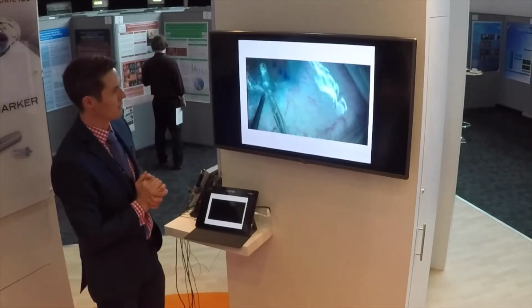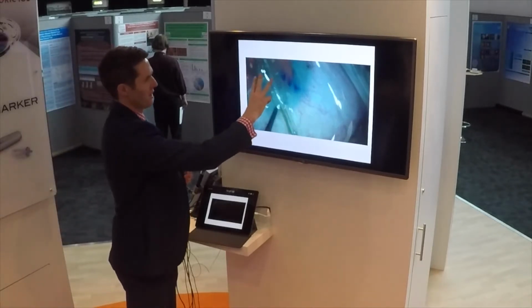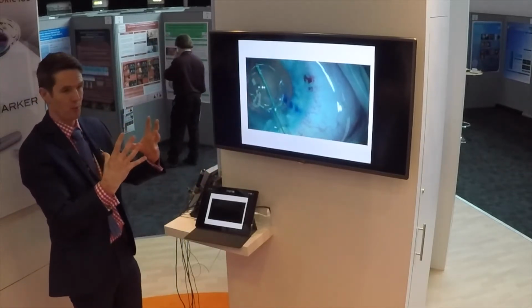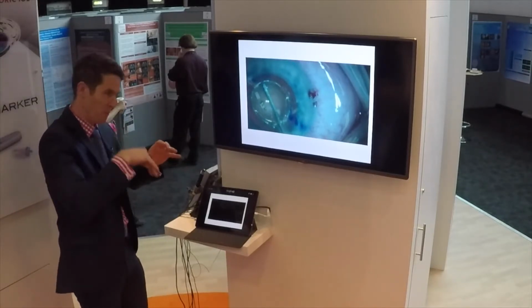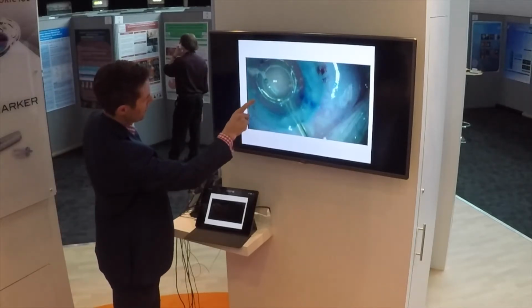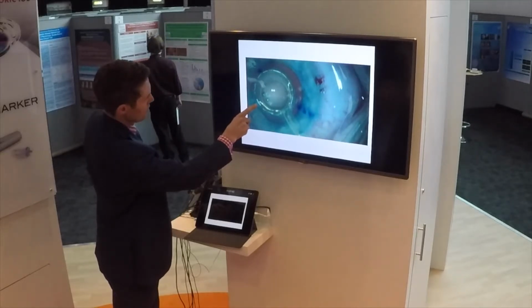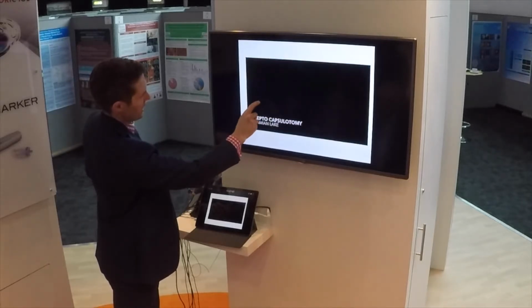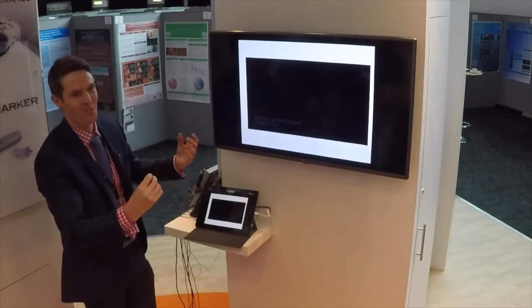It shows one of the problems you can get if you're not being careful. What you need to do is make sure the silicone cup is underneath the iris, so you can use it in small pupils. You do that by putting the viscoelastic under the iris to lift it up and then putting the cup underneath the iris. But I wasn't paying attention here, and I think some of it gets sucked in. See, the iris gets sucked in a little bit here. And I've applied the vacuum, so it's sucking it in, and then my microscope failed. Just at the right time. Real life surgery.